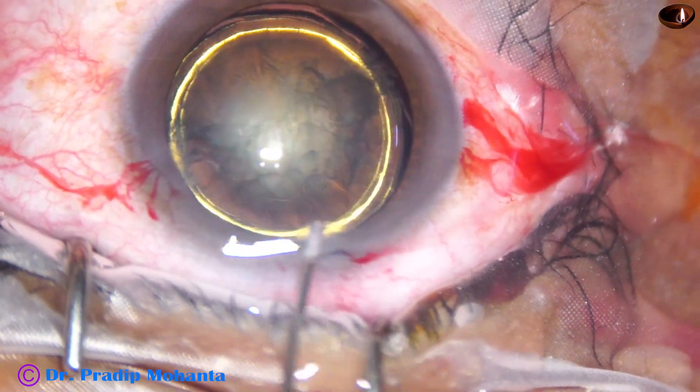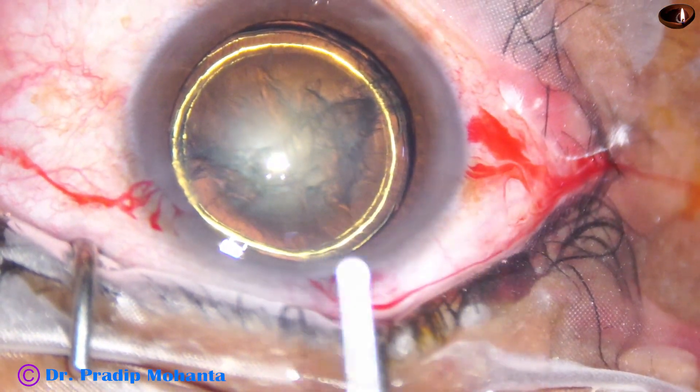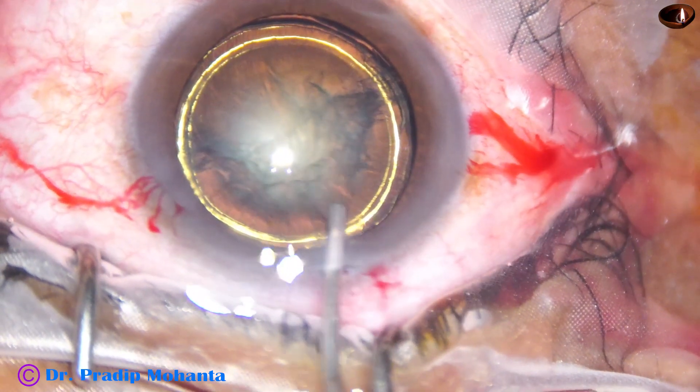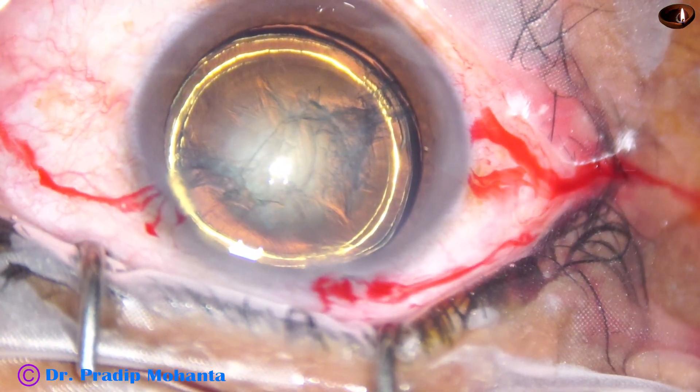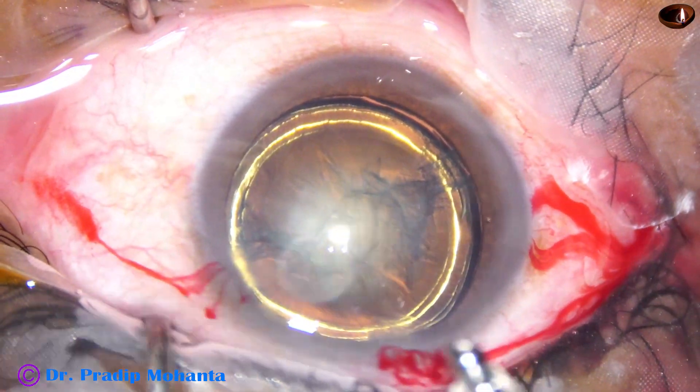How many golden rings can you see in this case? You will see very shortly, very clear. Yes, you can see there are four golden rings. Beautiful.